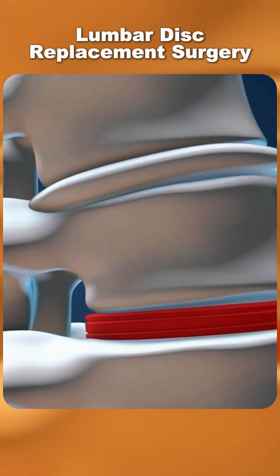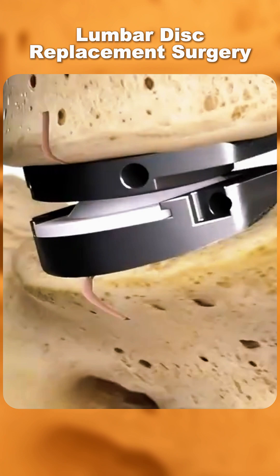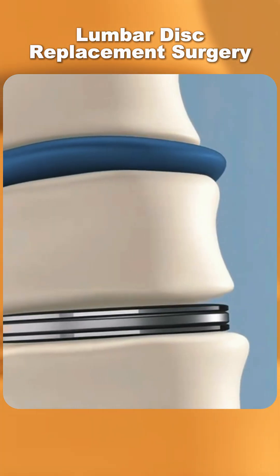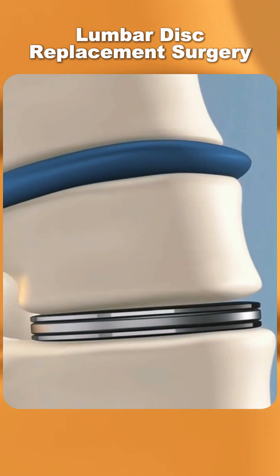Unlike traditional spinal fusion, which permanently joins two bones together, disc replacement preserves mobility in that part of the spine. After placement, surgeons check alignment to ensure stability, and the incision is closed.